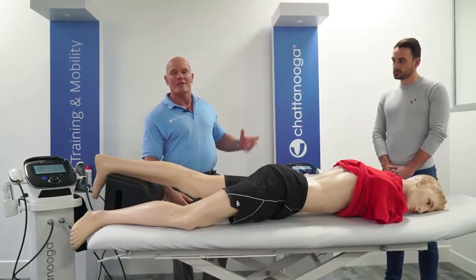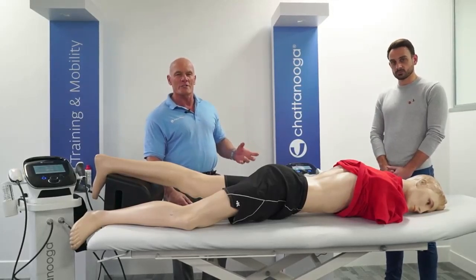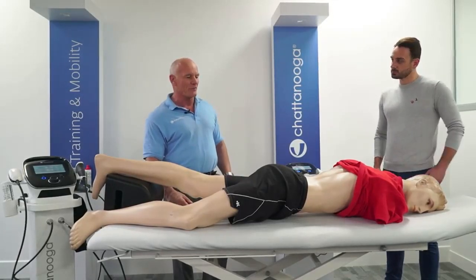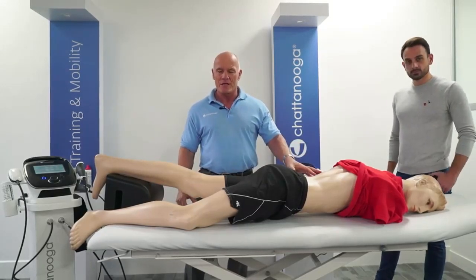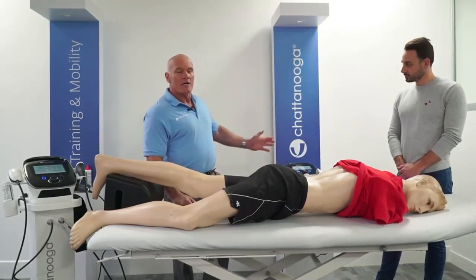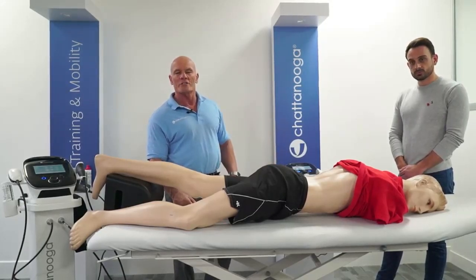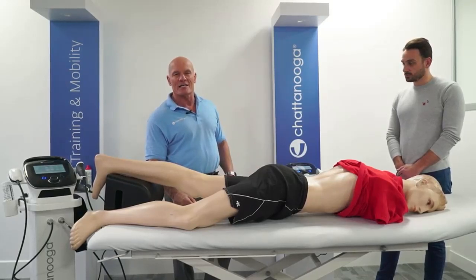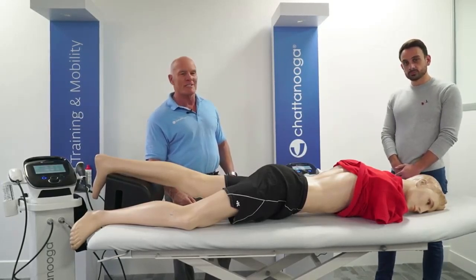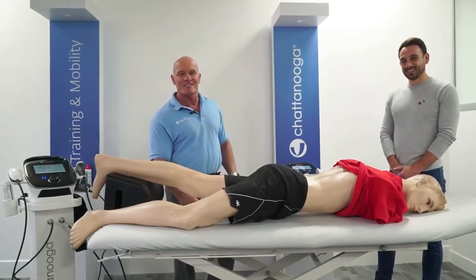And today we're going to be teaching him about the clinical use of radial pressure wave for the lumbar spine and also using ultrasound for treating osteoarthritis of the knee, for which Craig has a big interest. And hopefully Craig is going to answer the questions that you would have come to ask me on the stand in Dusseldorf.